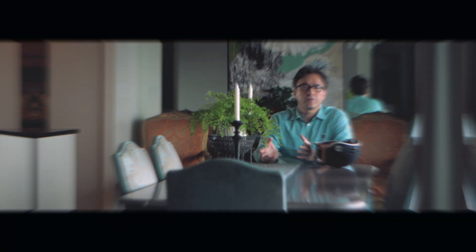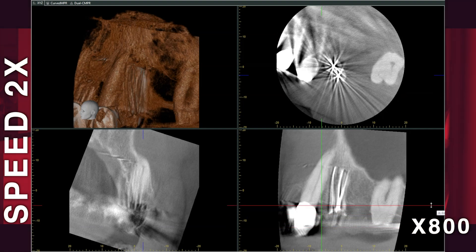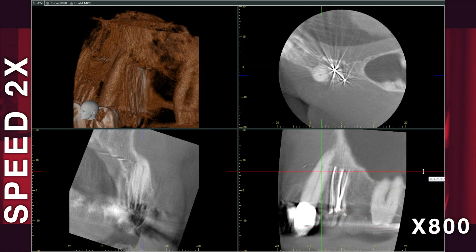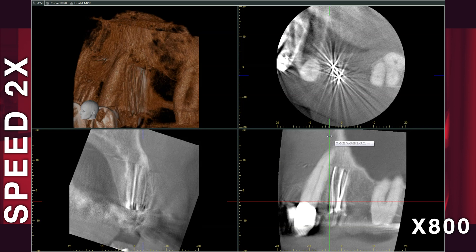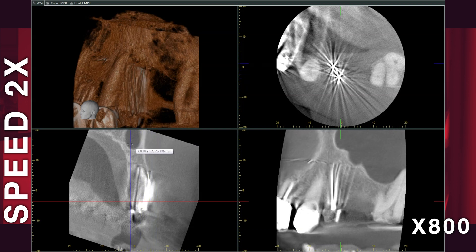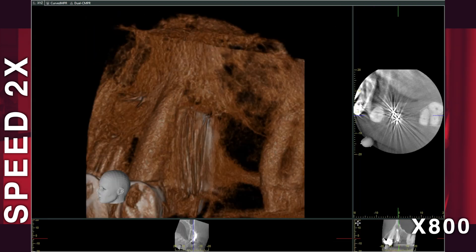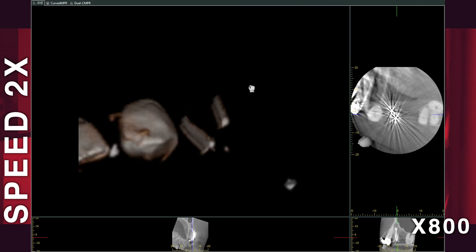I started the case by taking a CBCT with my X800 to see what was going on. Unfortunately, with a 360-degree rotation on the X800, silver points still produce a lot of scatter. As a result, the 3D image only told me that we have two roots angling in different ways and that there is no periapical lesion — further confirming that it's going to be a more difficult silver point removal.